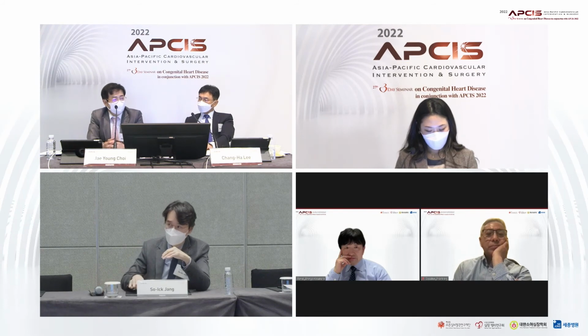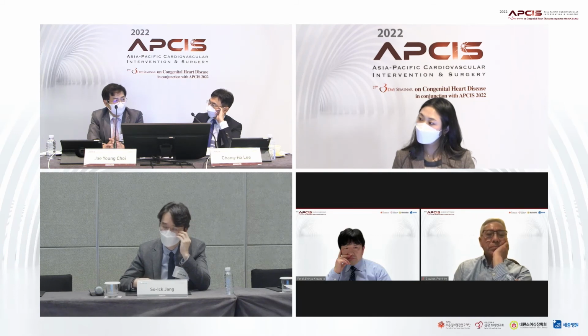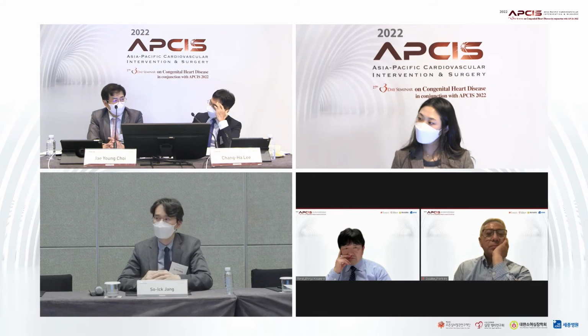Frank showed us many stent techniques, including the V stent technique, the kissing technique and the tandem technique. Since this is a trifurcation stenosis, I think the tandem stent technique or the kissing technique would be the two options. What would you prefer?